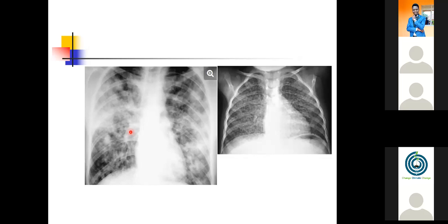And it leaves us with more room to pronounce it as just patchy consolidations.